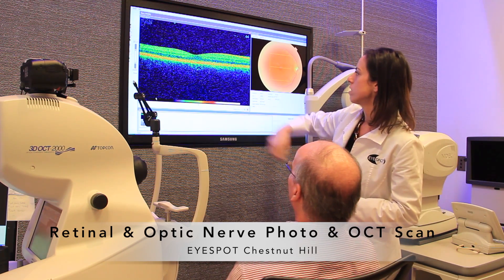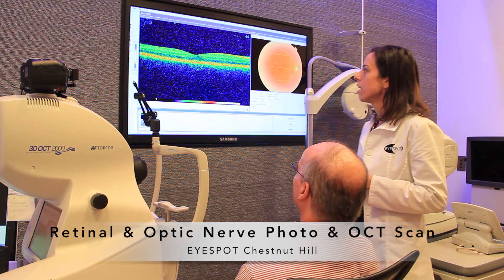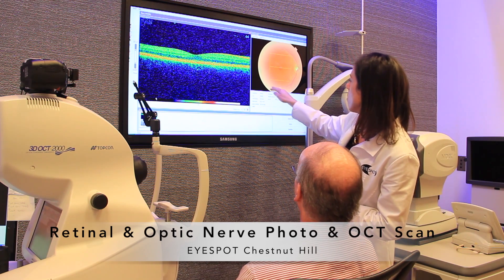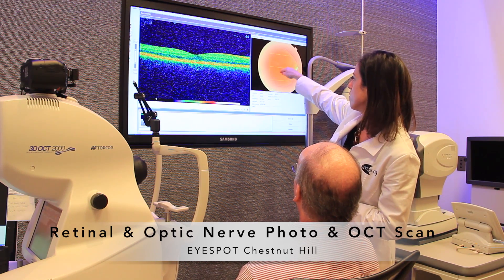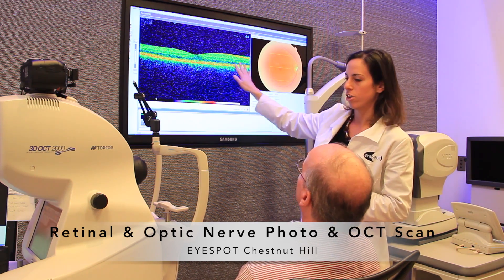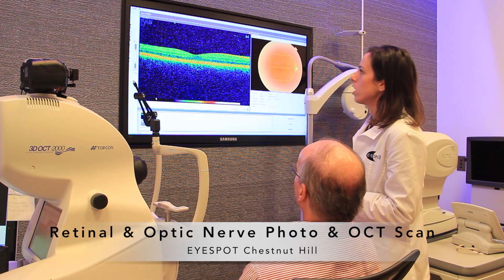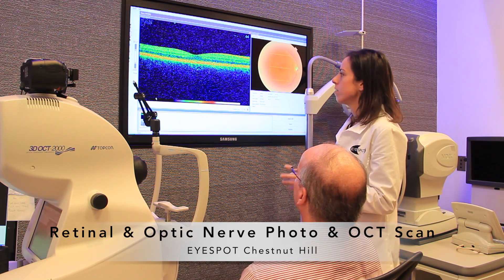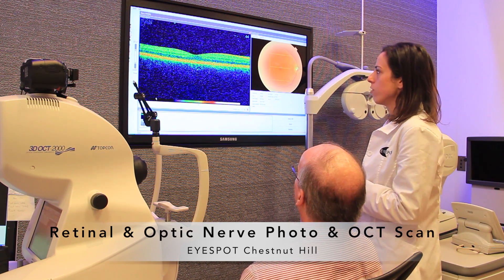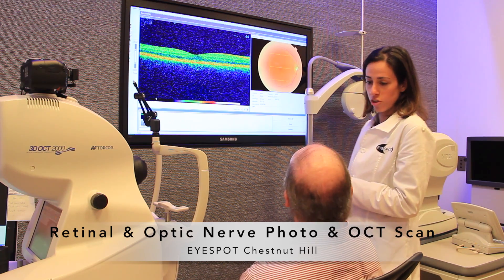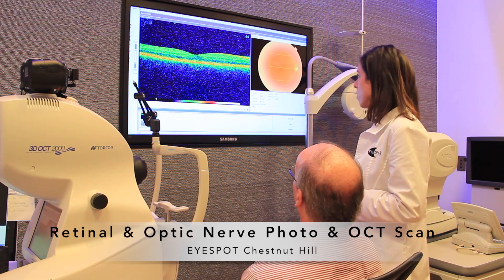Over here, this is a high definition OCT scan of the retina. If you were to take tiny little slices of the back of the eye, they come out in this picture here. Things I'd be looking for would be any signs of diabetes, macular degeneration, or other systemic problems which can show up in the eye — and I'm not seeing any of that. Everything looks nice and healthy.